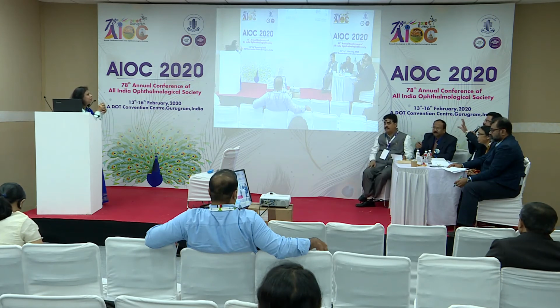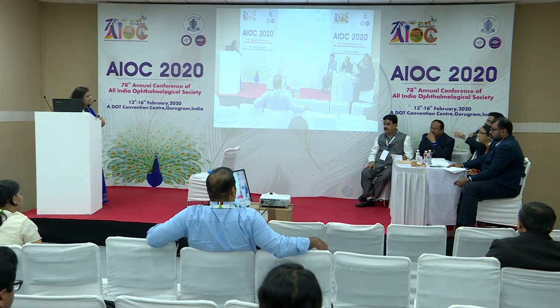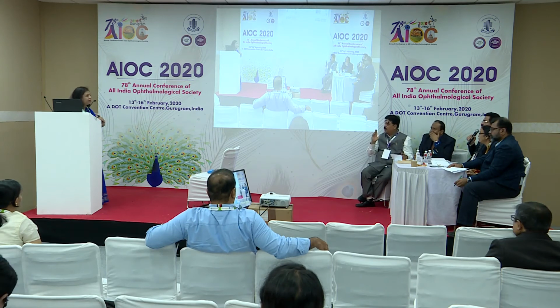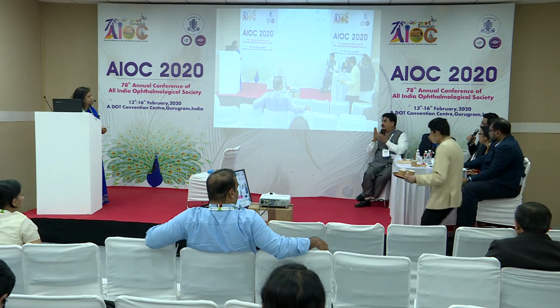Now the manual machine, they must have mentioned, is measuring keratometry at 2.2, 1.8, 2.3, what? Sir, it is the usual manual machine which takes only the central 2 millimeter of the cornea. I doubt it, ma'am. Please check it again. And second thing, who was doing the manual keratometry? Yourself, assistant? Sir, the optometrist was doing it, the person who does the biometry.